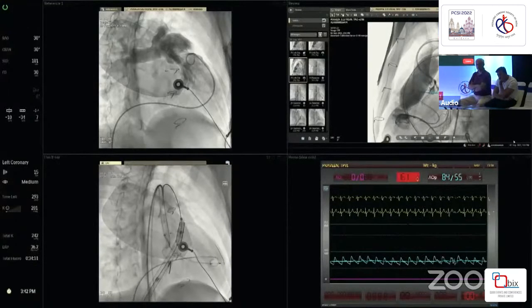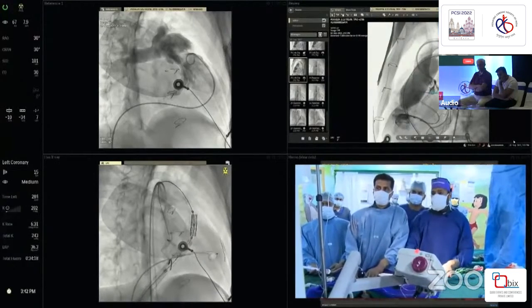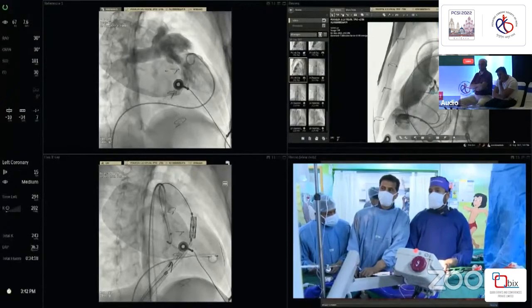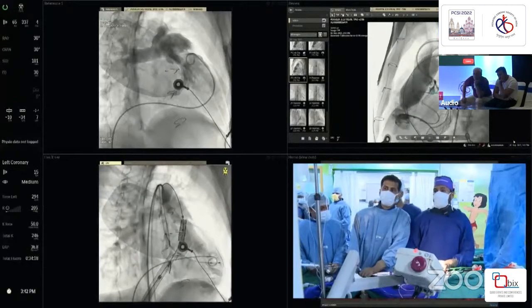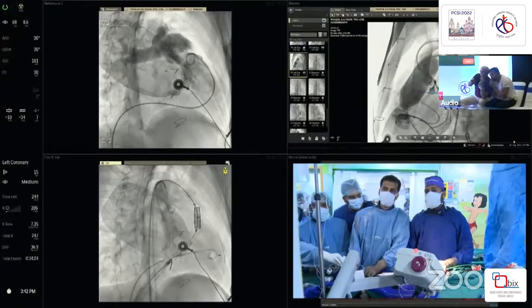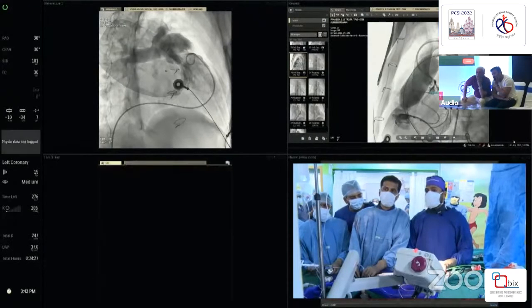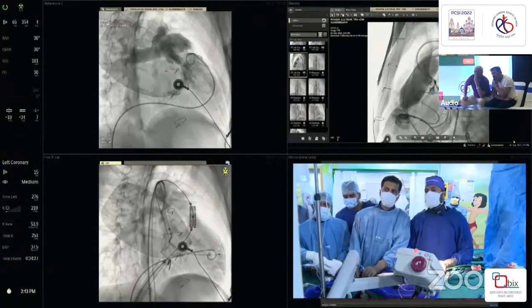So let's do an injection. I think I'm across, sir. Landing zone. I'm going to push it a bit further. Okay. You check it. Little angiogram. I think, see, we had that second marker wire. Okay, ready? Injection. It'll go up a bit more. Little bit go up. That's enough. Okay. One more injection, please. Ready? Okay, I think you're okay. Bit more up, sir. Slightly more up.